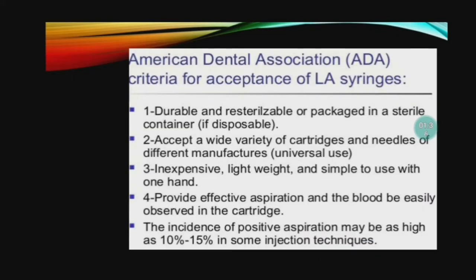American Dental Association, or the ADA, criteria for acceptance of LA syringes. 1. Durable and sterilizable, or packaged in a sterile container if disposable. 2. Accept a wide variety of cartridges and needles of different manufacturers, universal use. 3. Inexpensive, lightweight, and simple to use with one hand. 4. Provide effective aspiration, and blood can be easily observed in the cartridge. Then, the incidence of positive aspiration may be as high as 10% to 15% in some injection techniques.